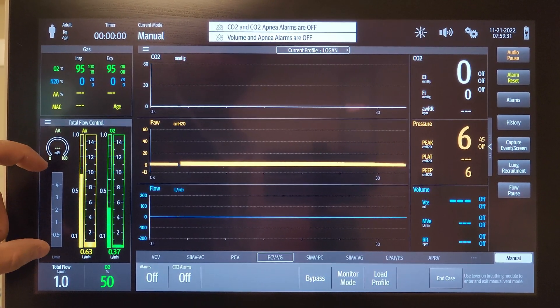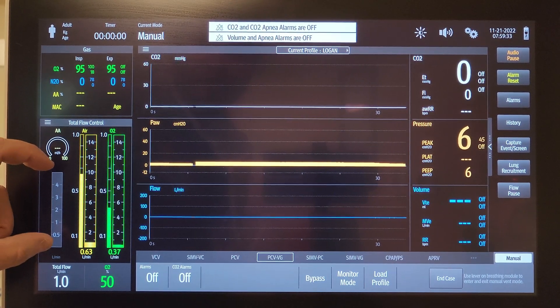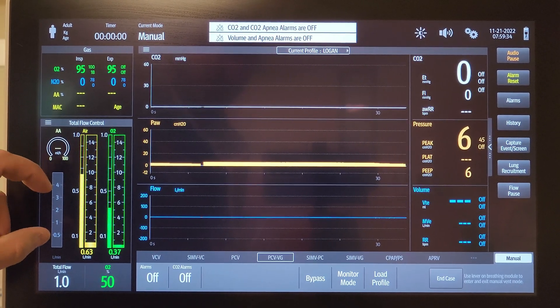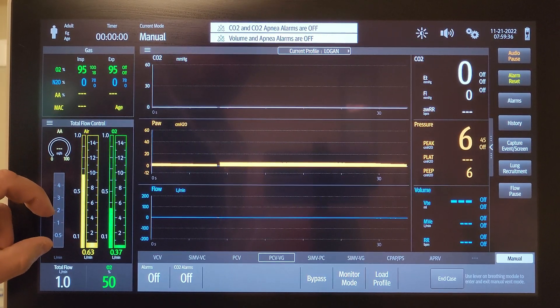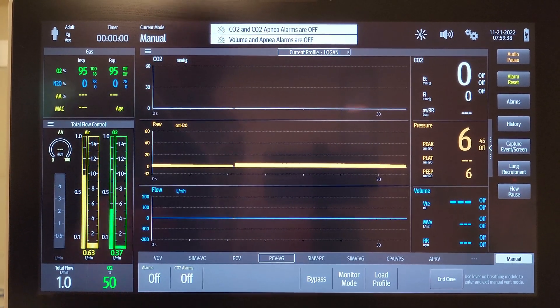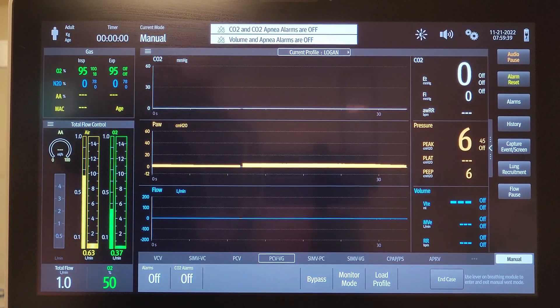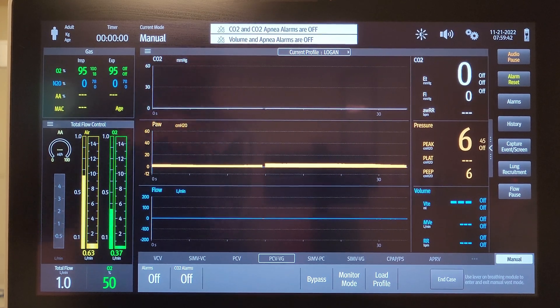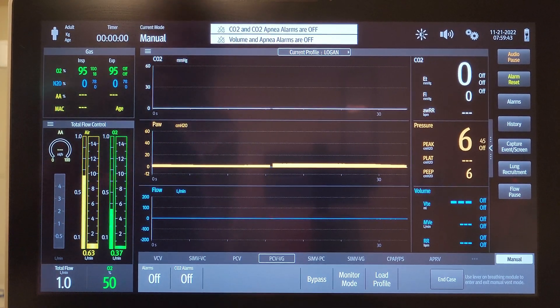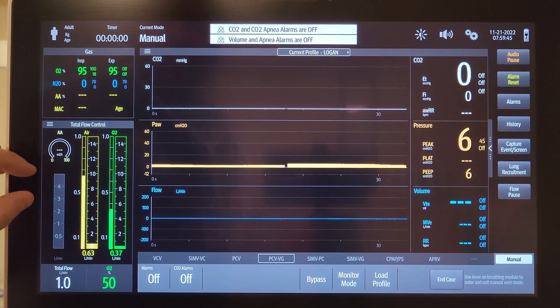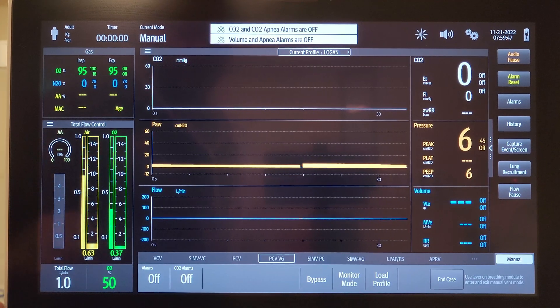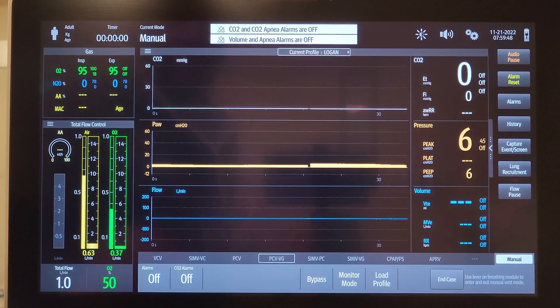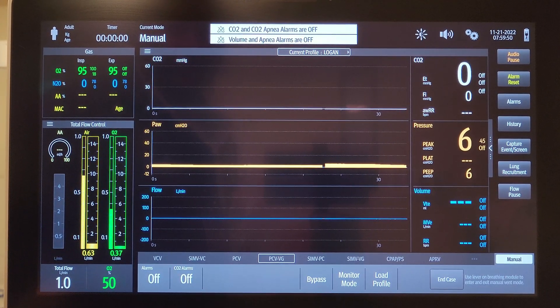If you're running a case with anesthesia gas, you'll then have an optimizer that shows up here under your flows. This is a recommendation based on your tidal volumes, the leak in the system, and compliance, to try to run you at the most efficient gas flows possible while you're running an anesthetic.